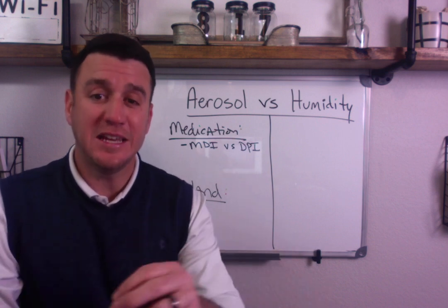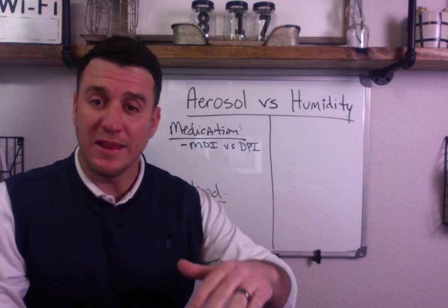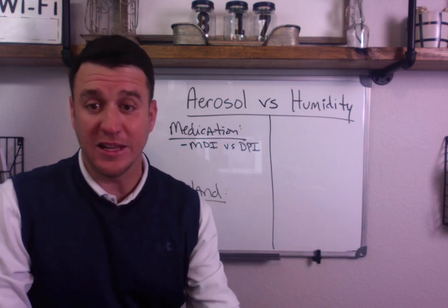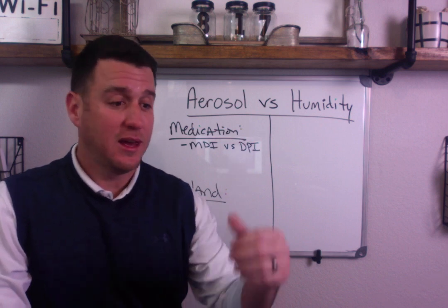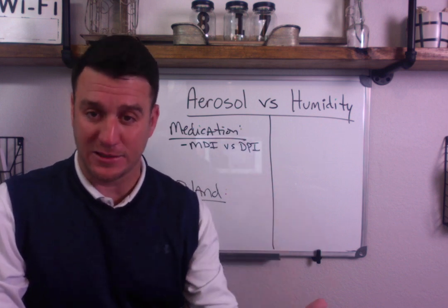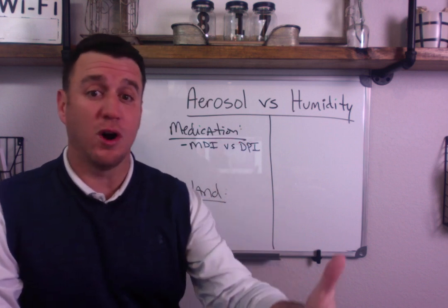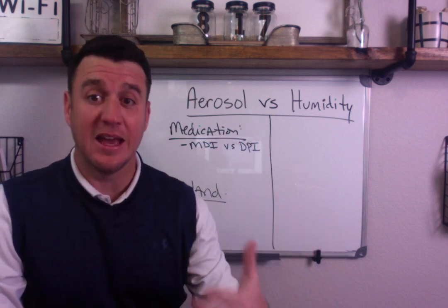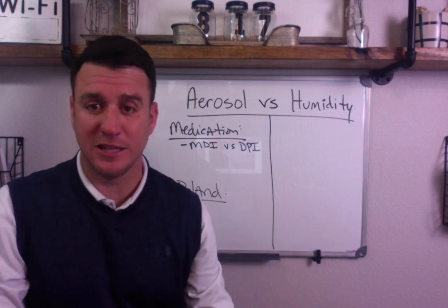Now, the function of a DPI and the way they work is they're based off of an inspiratory flow. So your patient has to breathe in deep and fast. When they breathe in fast, they will draw the medication out of the device and into their airways. Breath hold at the end maximizes deposition.